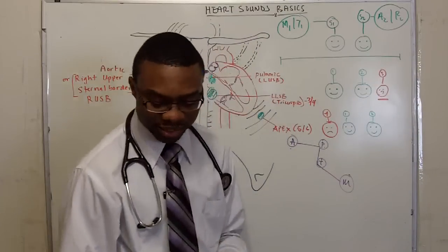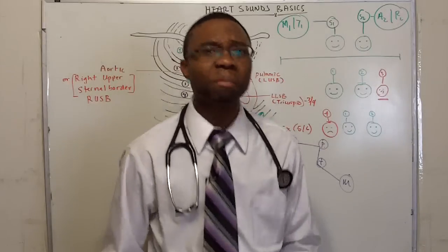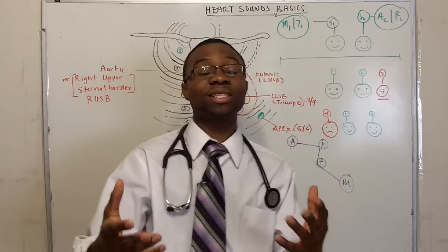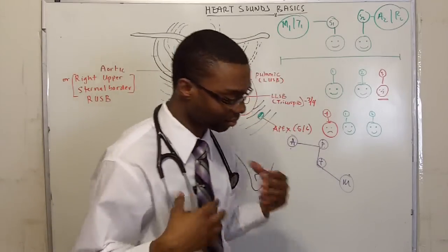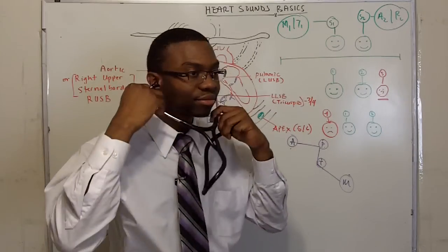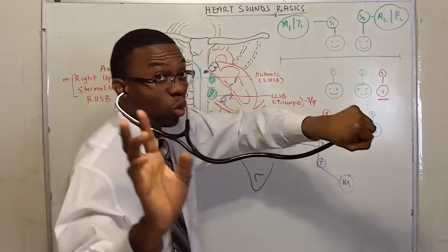So most people say Kentucky. You know what? I've said Kentucky for so long, I never remember it because I don't know what I'm listening to. So my attending, Dr. Scott, said, this is how you hear S3. You put on your stethoscope, just like that. We place this in our hands. And this is 1-2 again.